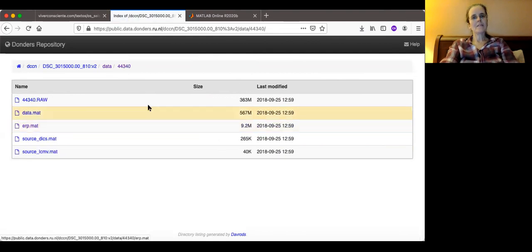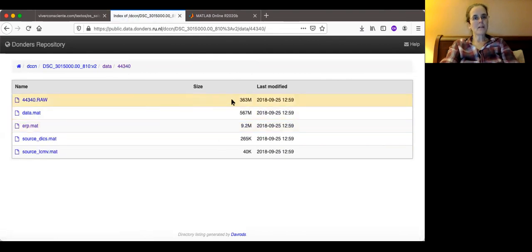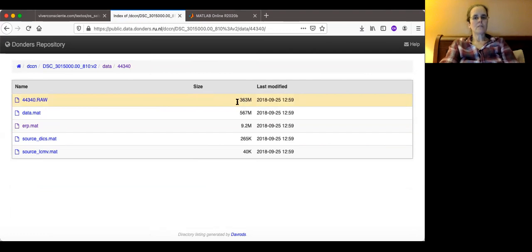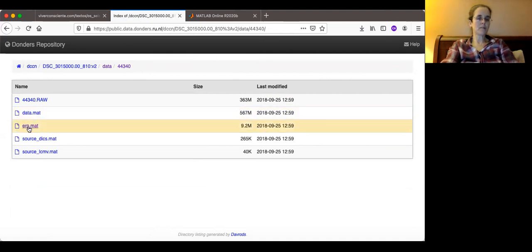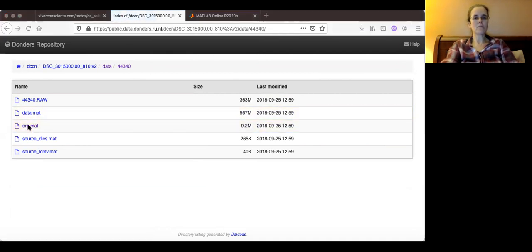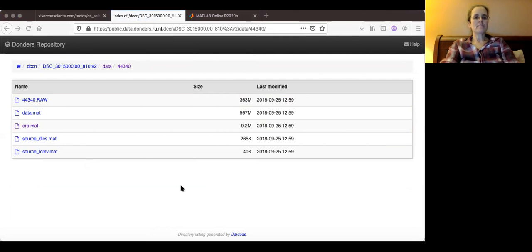The problem is that the raw data is 360 megabytes. The .mat is 600 megabytes. So I'm going to download the ERP, the event-related potentials, and I'm just going to save this for now.